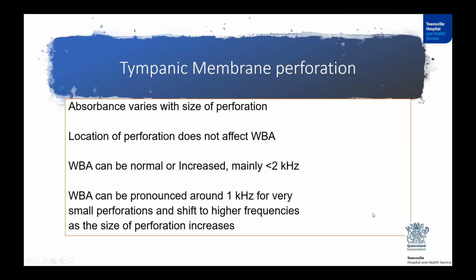Now, with tympanic membrane perforation, there are a couple of studies that have done some on modeling, some on cadaveric ears and some on case studies. The overall agreement is that absorbance varies with the size of the perforation. The location of the perforation doesn't affect the wideband absorbance. Whether it's an anterior or a posterior perforation doesn't affect absorbance much, but whether it's a pinhole perforation, a small perforation or a large one does.